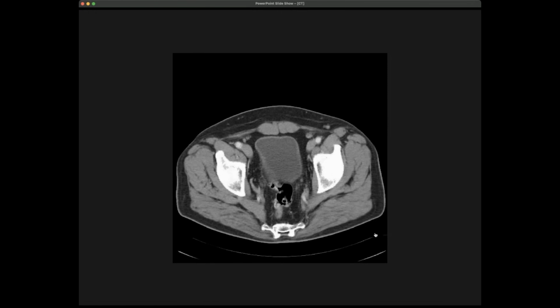Obviously, you're not going to make this table out of metal, because if it would be a metal table, metal would absorb a lot of X-rays. And then, of course, you would lose a lot of X-rays when you go through the table, which of course you don't want, because that means that you have to increase the dose in order to be able to get some useful information. So that's why you try to find a table which is solid enough for a heavy patient to lie on, but which has as little attenuation for X-rays as possible.